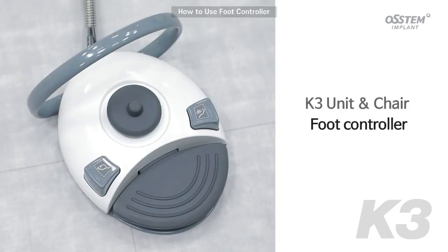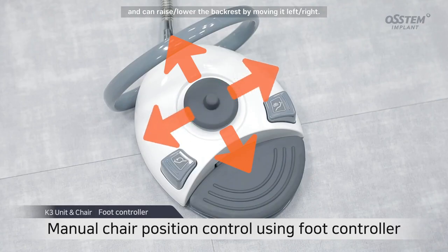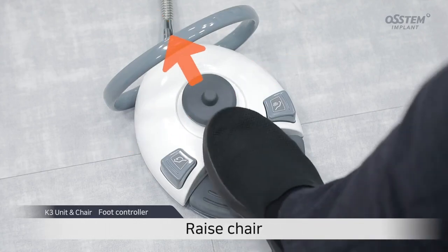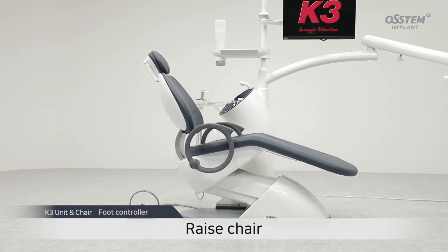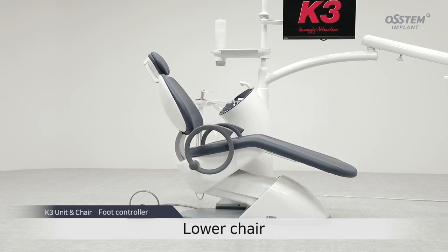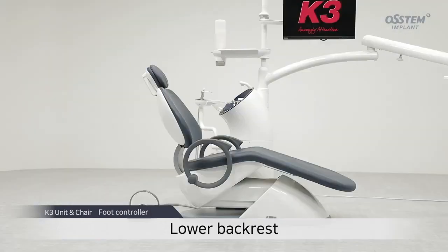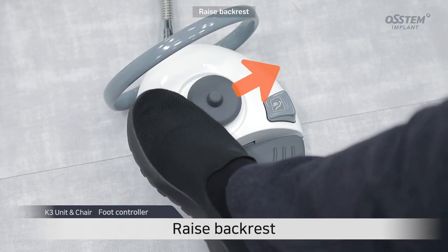How to use the foot controller. You can manually raise or lower the chair by maneuvering the joystick up or down, and can raise or lower the backrest by moving it left or right. Raise chair. Lower chair. Lower backrest. Raise backrest.